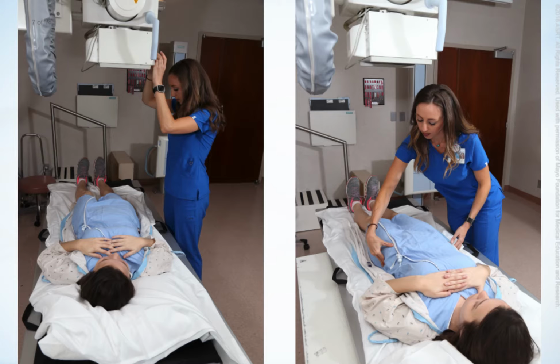The AP projection for a unilateral hip examination is performed with the patient positioned supine on the radiographic table and the leg extended. Have the patient place their arms in a comfortable position outside of the field of view. To ensure the pelvis is not rotated, adjust the patient's position so that the anterior superior iliac spines, or ASISs, are equidistant to the radiographic table.